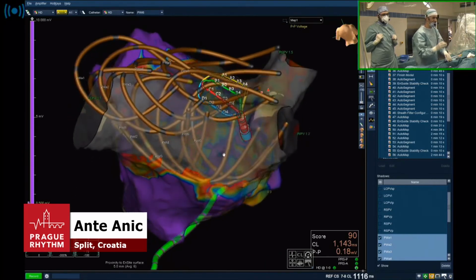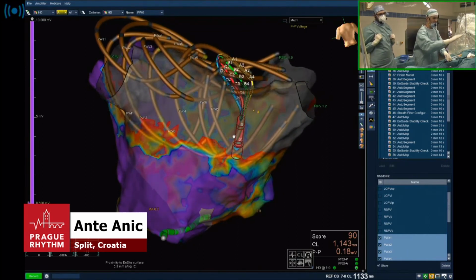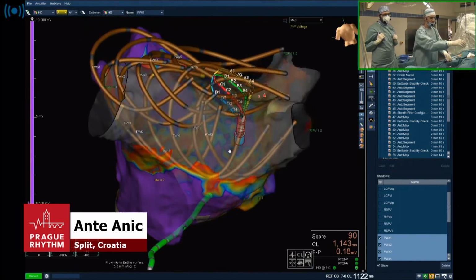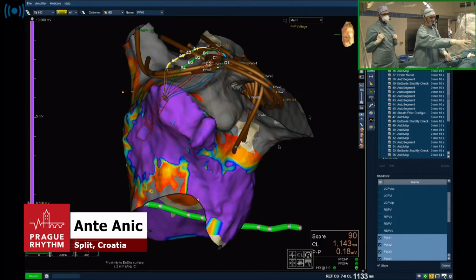You see that our lesion set is very nicely correlating with the post-ablation map. The sharp edges, no fragmented activity on the edges. Can you go LAO? And you see clearly that the appendage is, of course, preserved. We know that there's no delayed activation in the appendage, which we like.